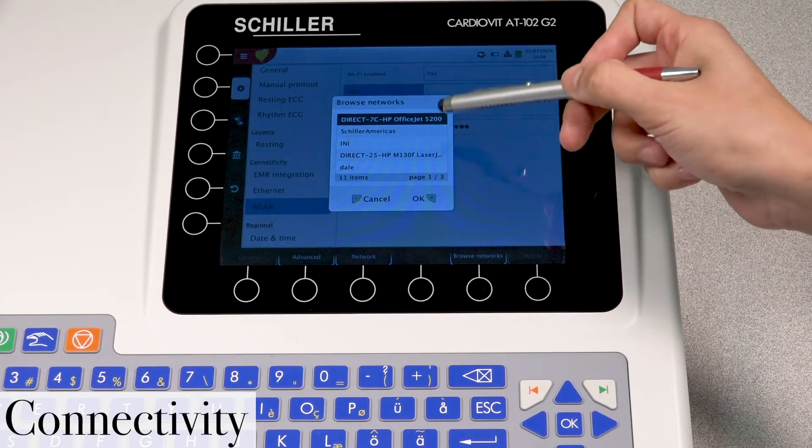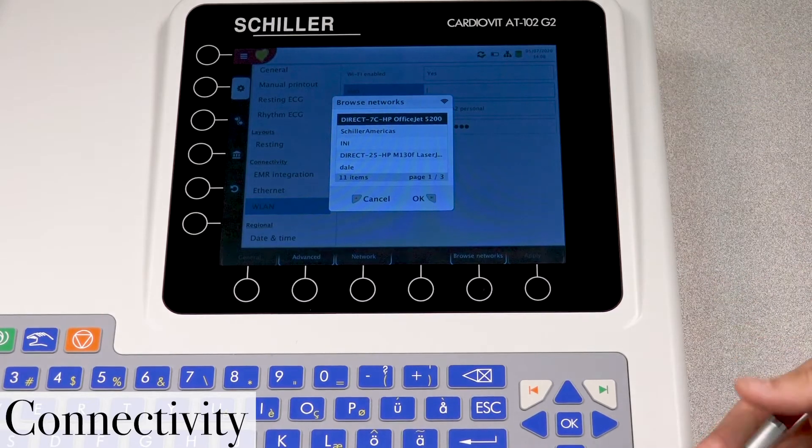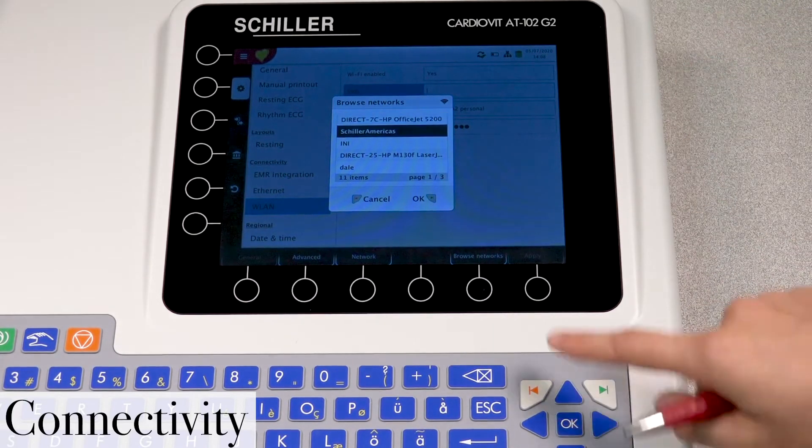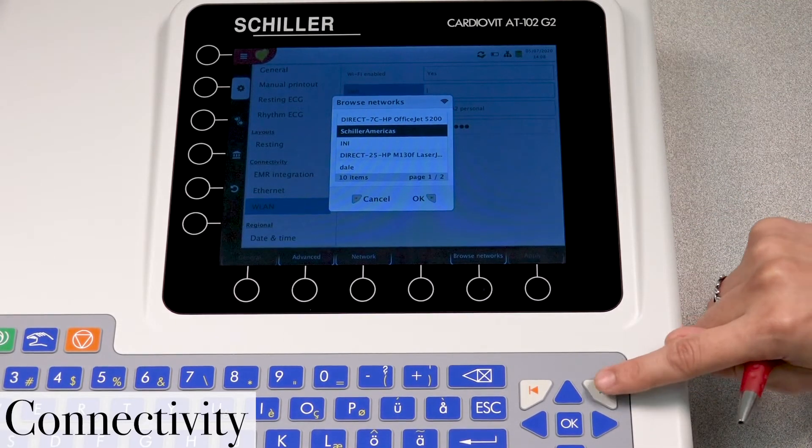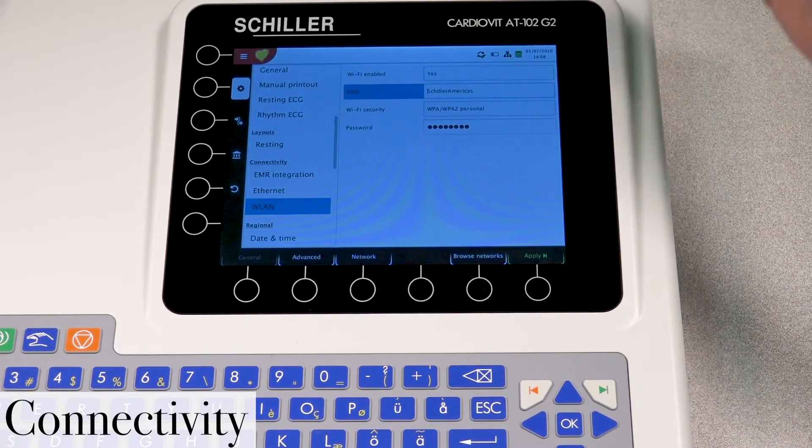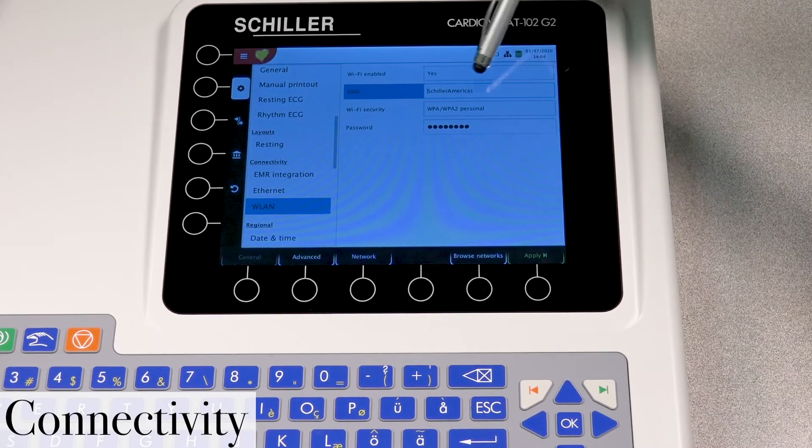And it's going to show you a list of all the different Wi-Fi networks available. In this case, we're going to select Shiller Americas. We're going to press this green button here for OK. And now we have the selected Wi-Fi network here.